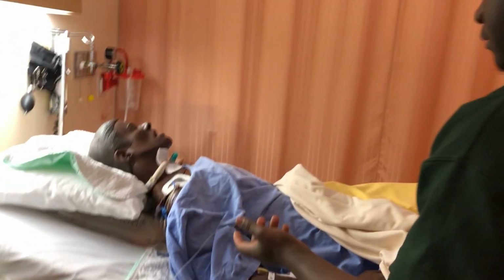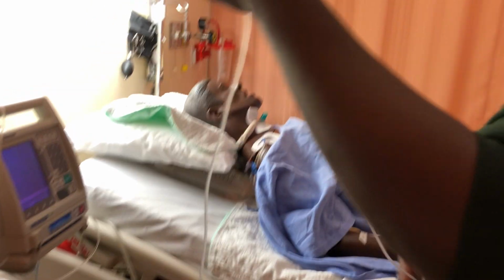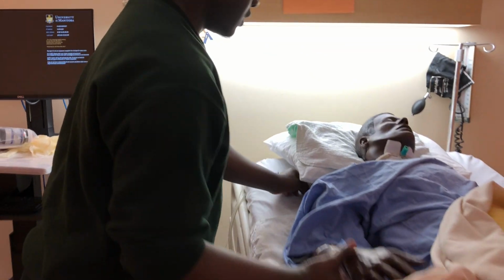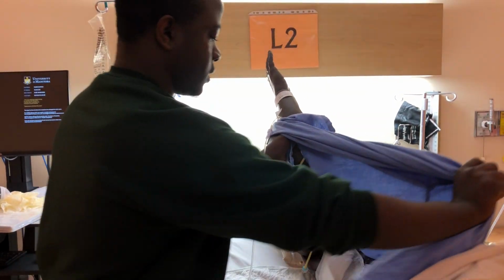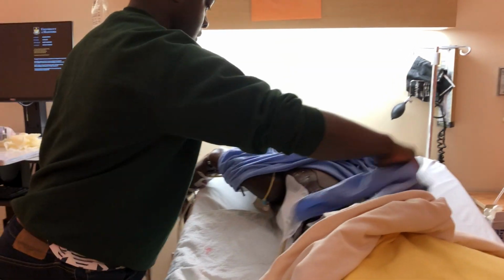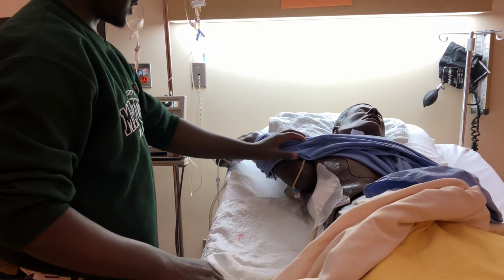First I will give the patient some privacy, like I already did, and I'll ask the patient if I can put his arm up to look at the dressing. So I'll put my patient's arm up right here so I can expose the dressing. So now I have my patient's dressing exposed.